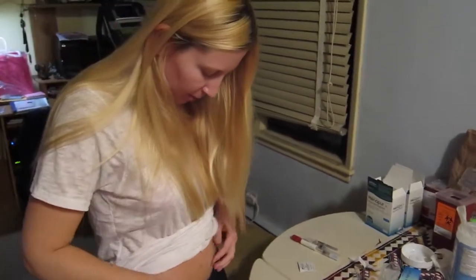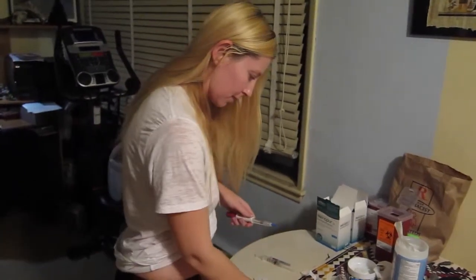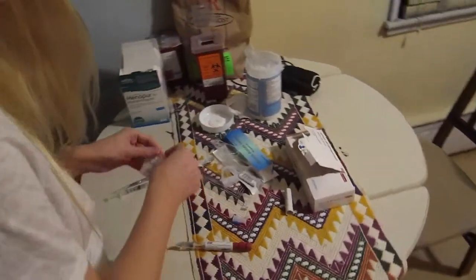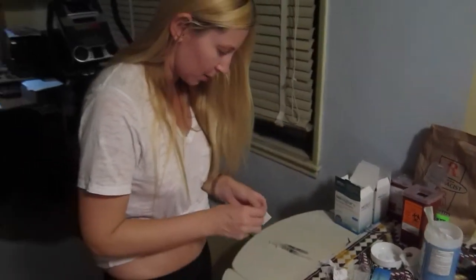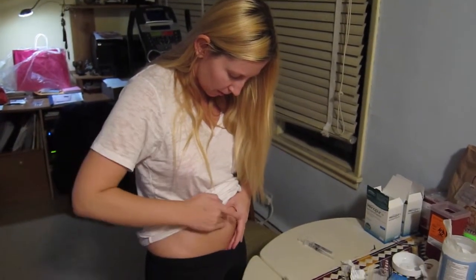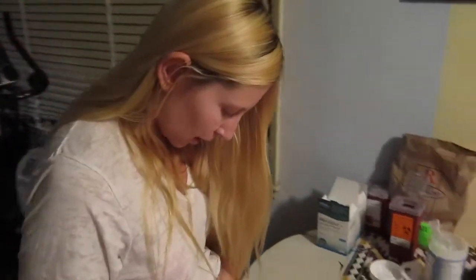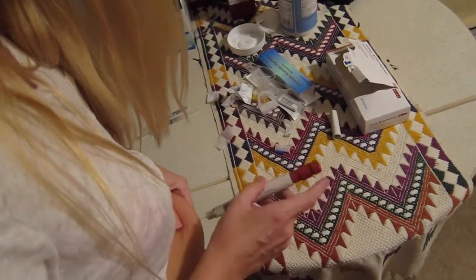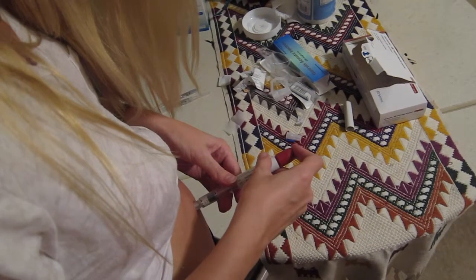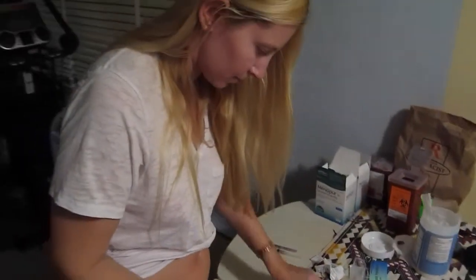I choose my belly because I think I have enough cushion to administer it there. I start with Gonal-F since I perceive it as less painful. I clean the area first, making sure I go from the inside out. I let it dry a little bit so it's not as bad. Then I pinch, inject, and slowly release. Make sure to release the pinch because otherwise the medicine won't go in — it would stay out. Then pull out. One is done. Just cover the needle.